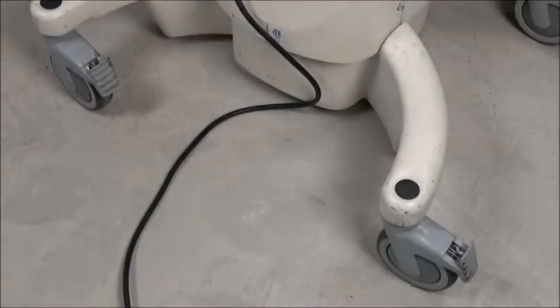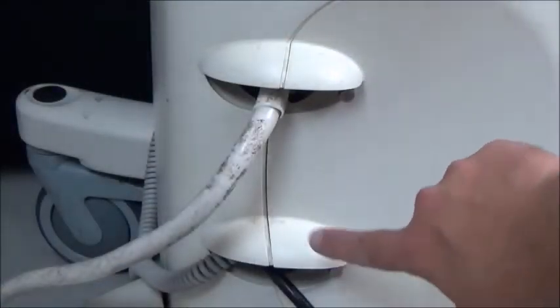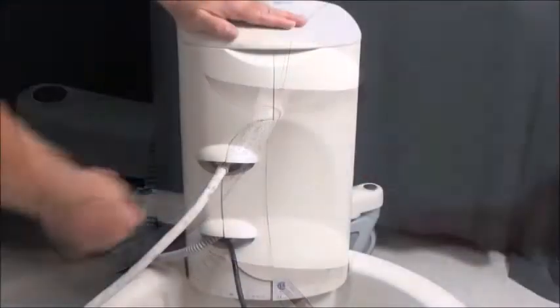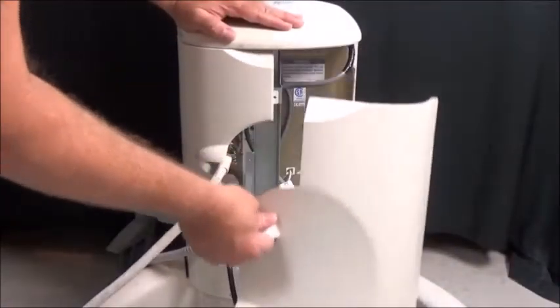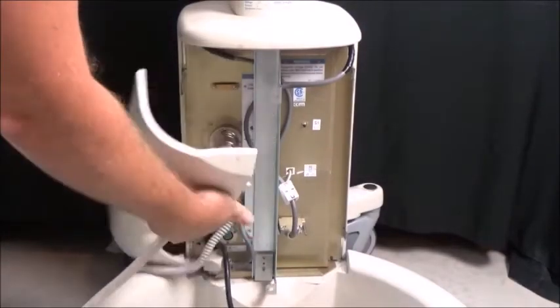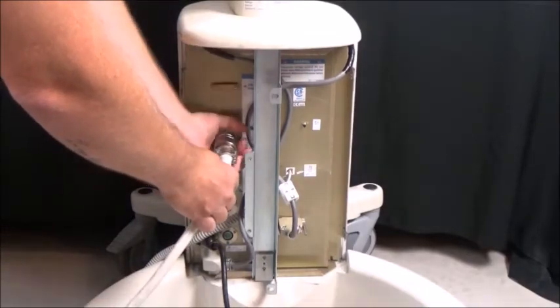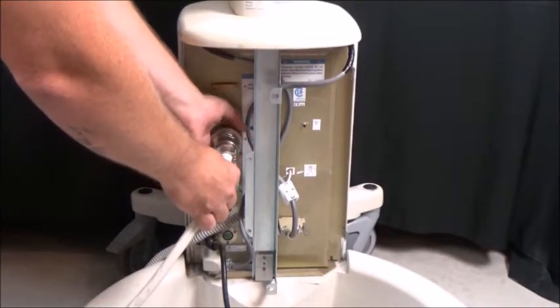For an all-in-one pedestal, lock the wheels on the pedestal. This will make it easier to remove the main unit. Remove the pedestal covers to reveal the main control unit. There are two screws on each side and two screws in the middle. Once the covers are off, unplug all the cables and remove the silver retaining bar.